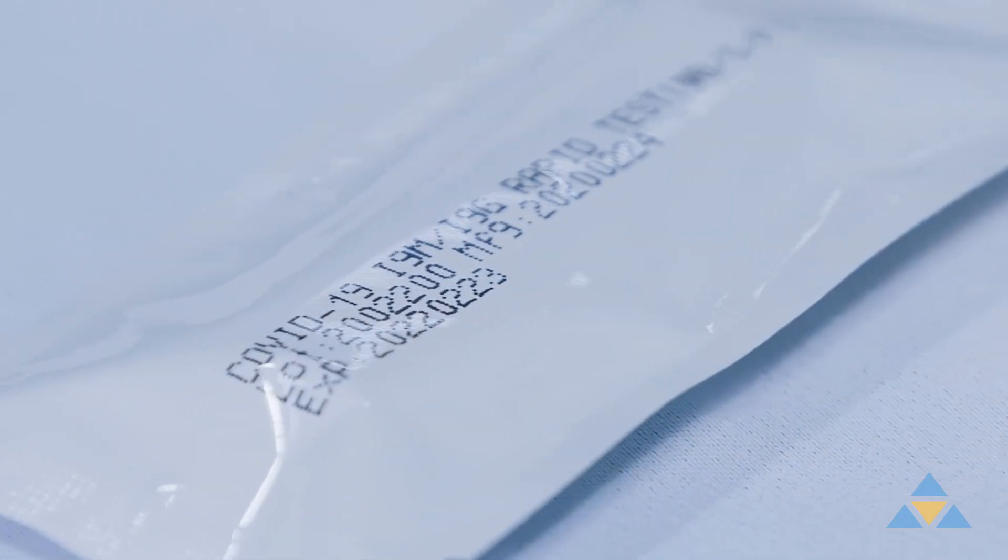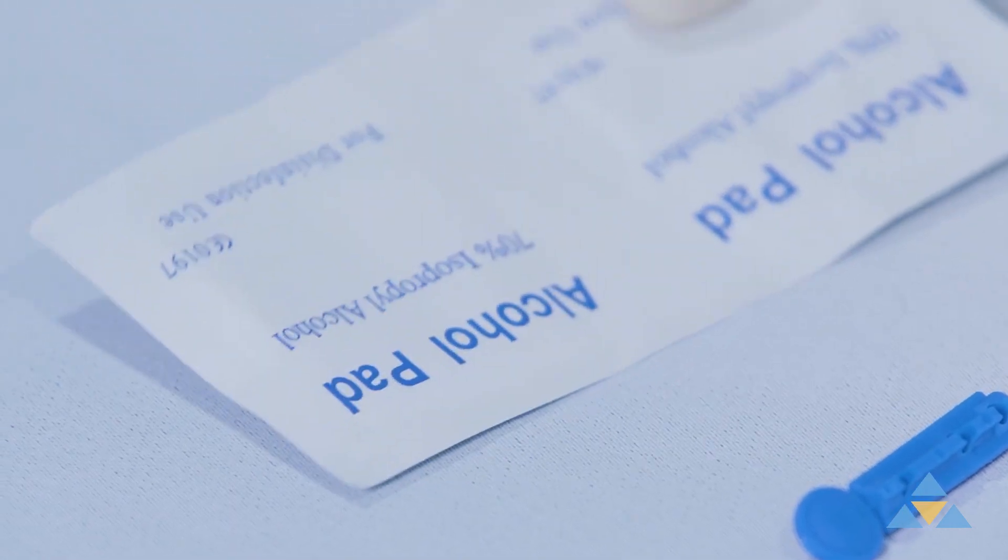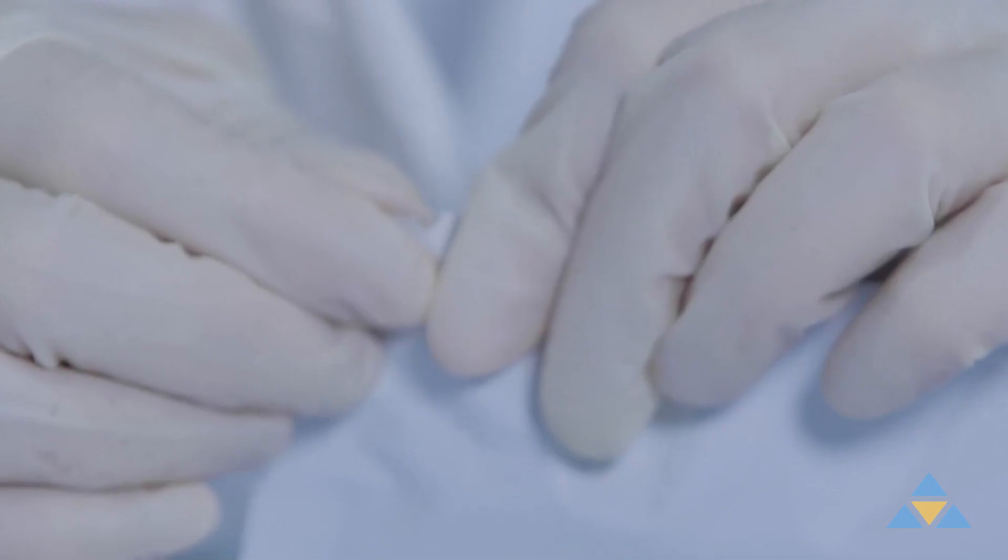Your kit consists of a testing cassette and a buffer and dropper. A lancet and alcohol pad are needed but are not included in your kit.